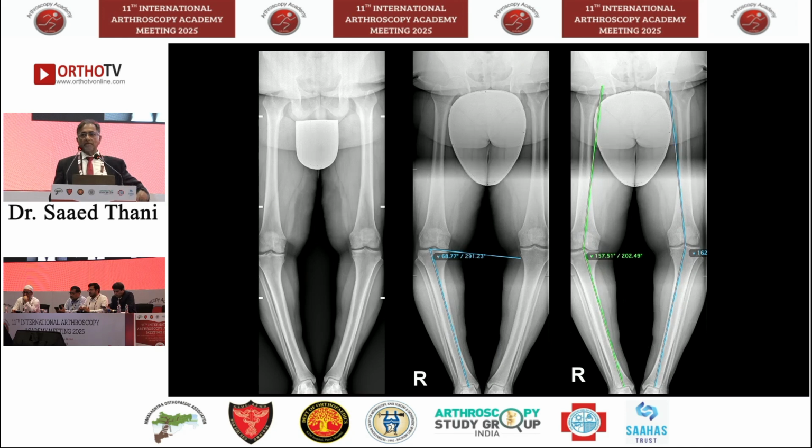So you can see the tibia on the right side is about 22 degrees of varus compared to the left side, which is about 18 degrees of varus. The question was, he was seen by several surgeons where it was indicated that he might need surgery on both the femur and tibia. I disagree, and we thought we can do it all from the tibia.